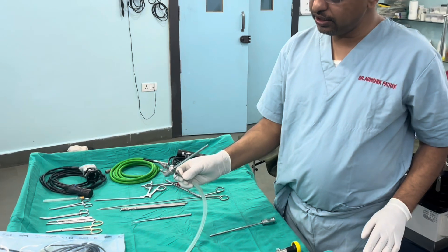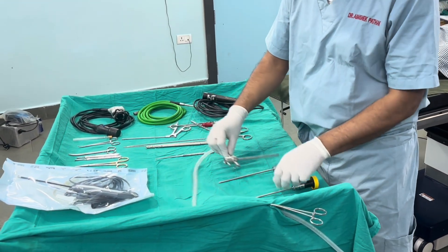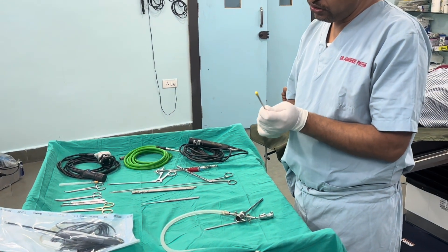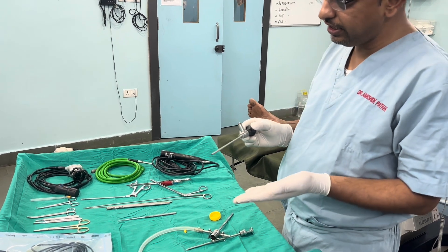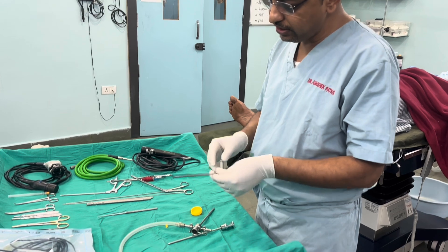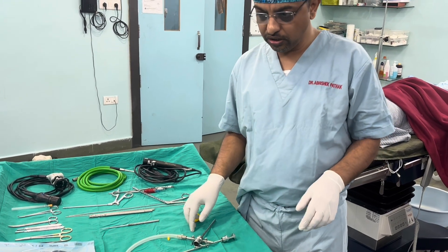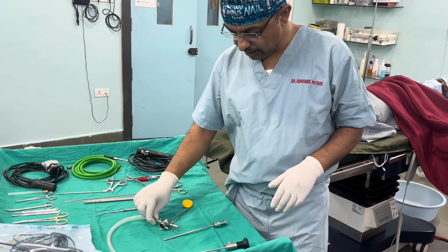The trocar sheath consists of a sheath and a trocar. The arthroscope used here is a 4mm 30-degree scope, which looks 30 degrees down. There is also a 70-degree 4mm scope which looks 70 degrees down, used mainly for cruciate reconstruction and in shoulder arthroscopy when viewing deep structures.